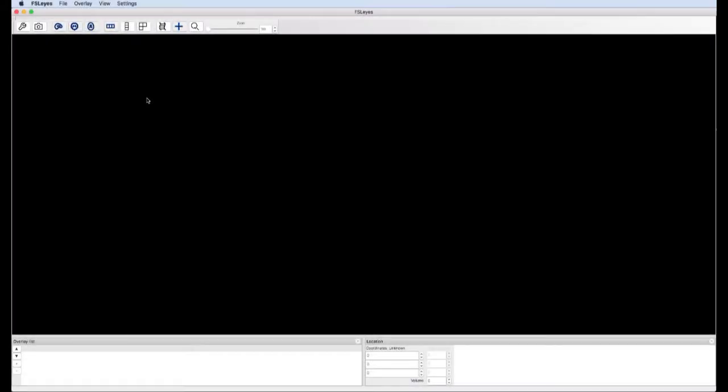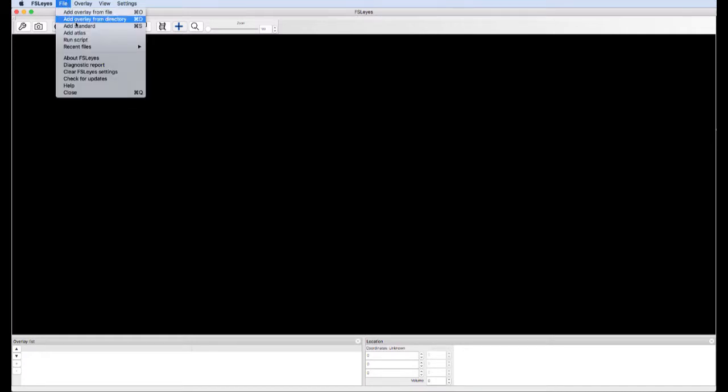Now let's take a look at atlases, maps indicating which voxel belongs to which structure.